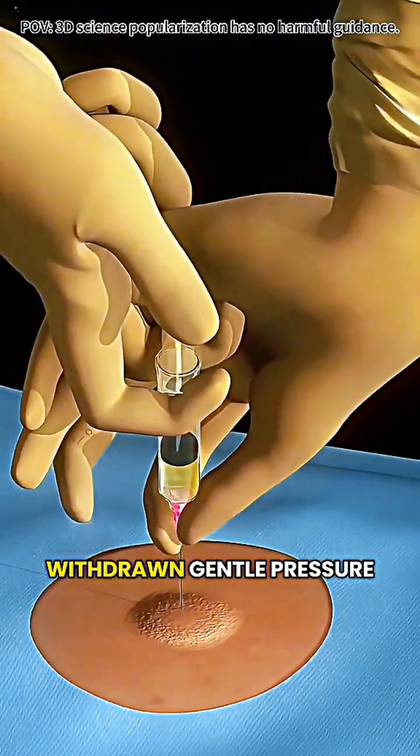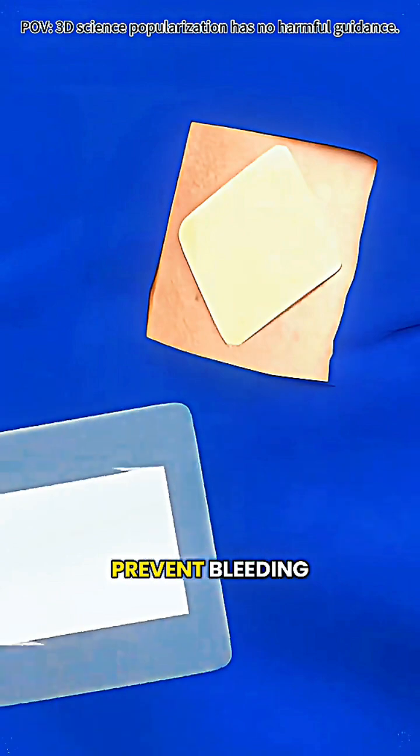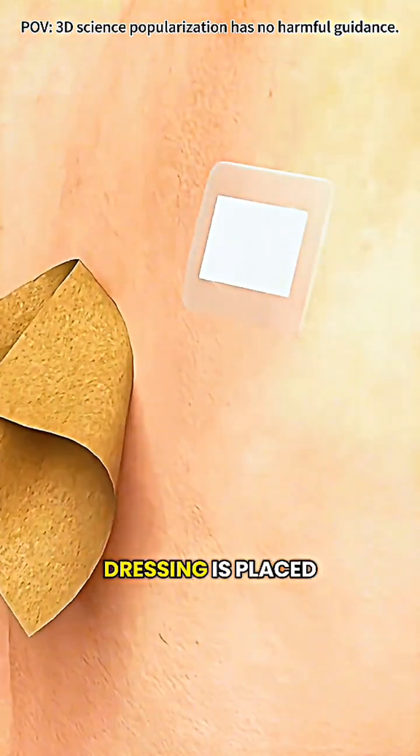After the fluid is removed, the needle is withdrawn, gentle pressure is applied to prevent bleeding, and a sterile dressing is placed.